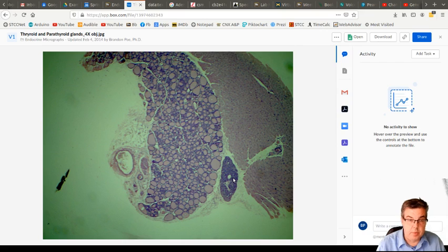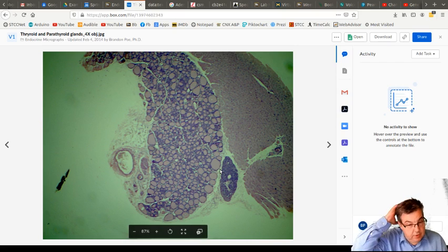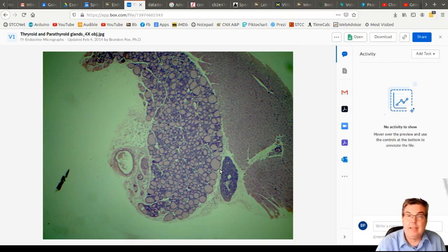Glandular tissue makes protein-based hormones, and the light staining nervous tissue is not making hormones, it's releasing hormones that are made somewhere else. Here, we're looking at tissue that has different staining qualities, and that influences what kind of hormones they're releasing.